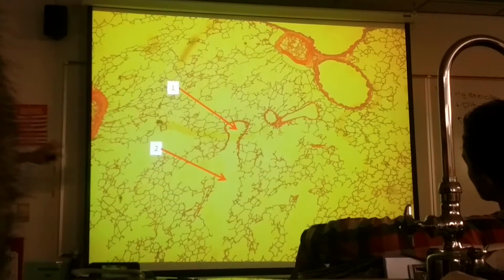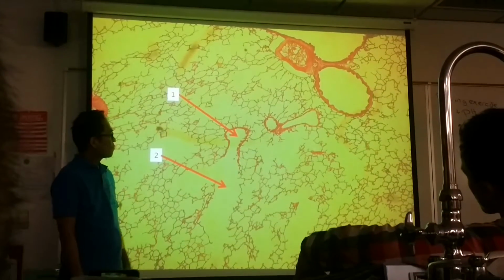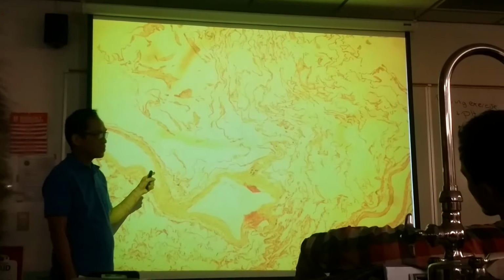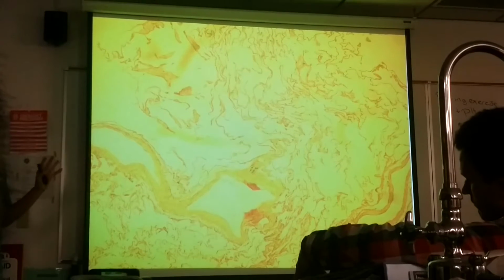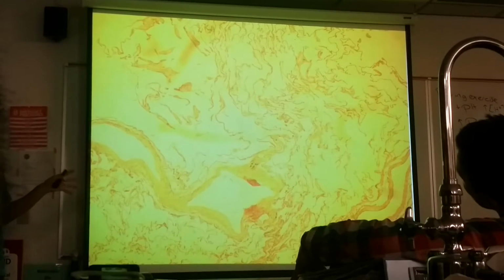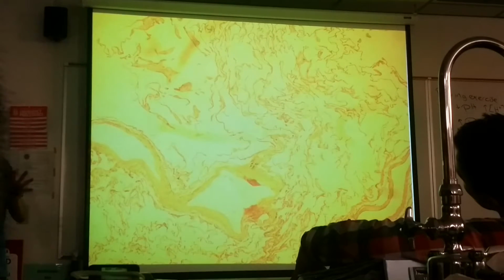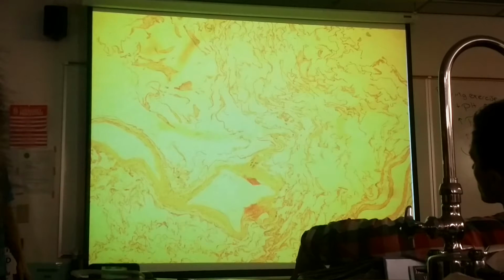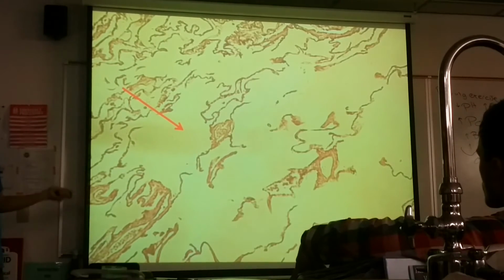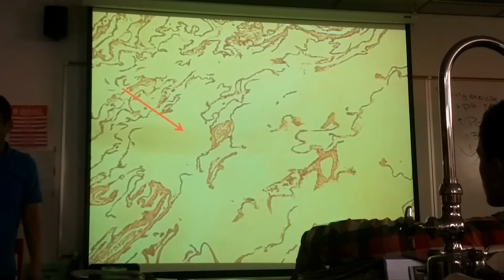So look, this is normal lung. Look at how organized the alveolar spaces are. This is emphysema lung. Do you see a difference? Yes. Okay, now if I were to describe the differences, the alveolar structure is broken down. Instead of many small alveoli, which is good, you have fewer alveoli, and the ones you have are larger. And larger isn't better. Larger is more inefficient gas exchange. I'm pointing to one. It hardly even has any structure. I mean, it just looks bad. This is emphysema lung.